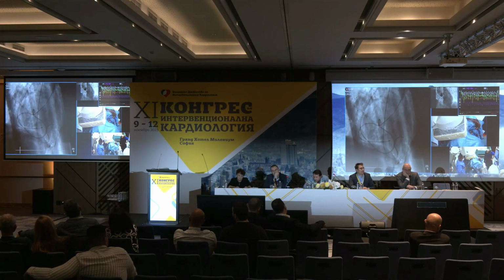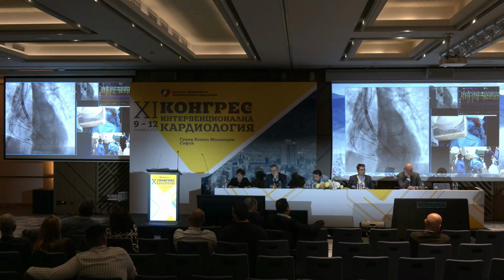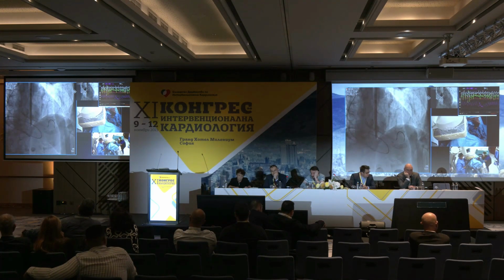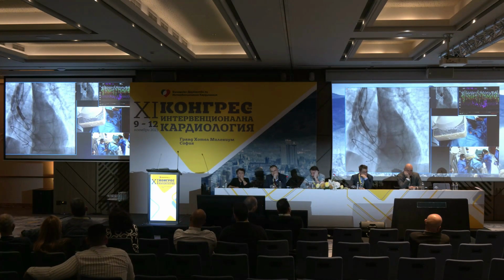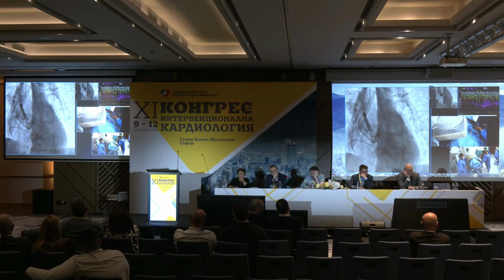We have implanted the valve. I think this is the most important piece of news. Okay, this is the check of the valve for the symmetrical loading, and this is step by step on 2 steps. So we open the valve up to the click, go back 1. Okay, this is the check after the click. We were happy with the position.